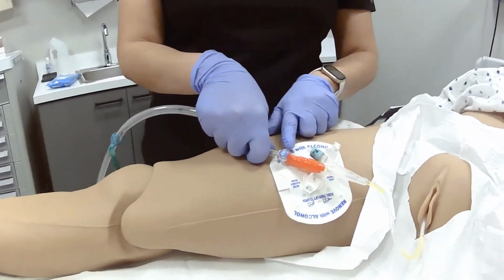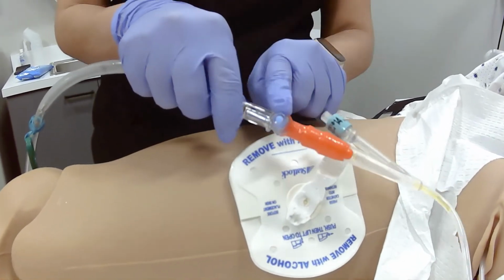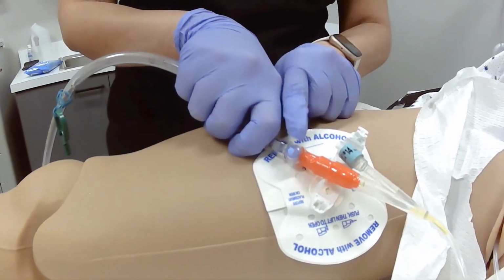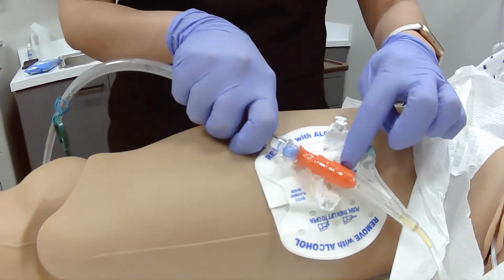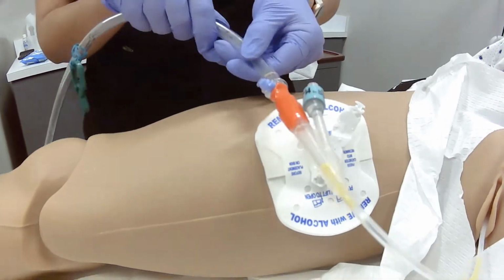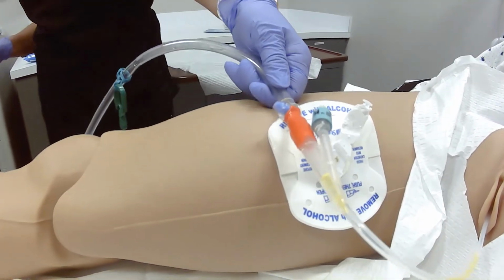So this catheter in particular has a port here that we're going to use to collect urine. You're also going to have a seal, so this seal keeps the catheter system intact and sterile, so that we don't get contaminated.